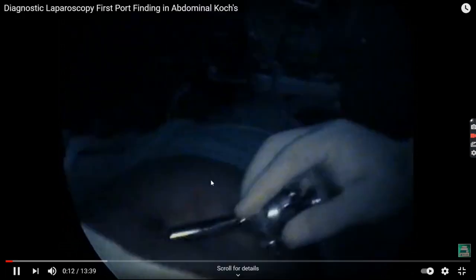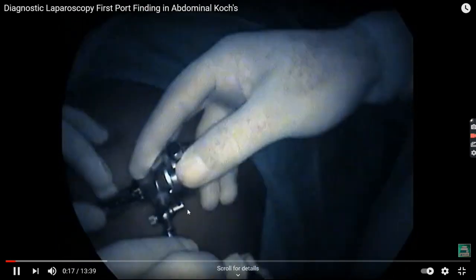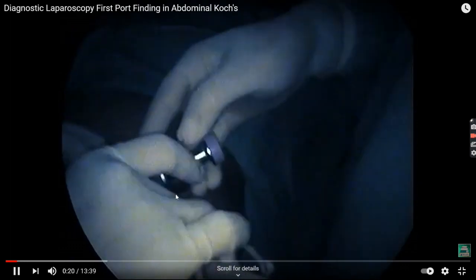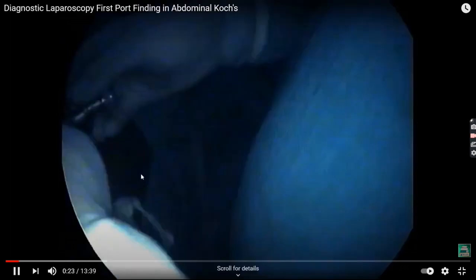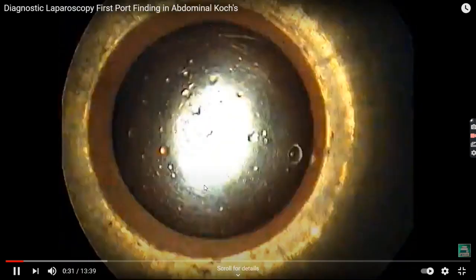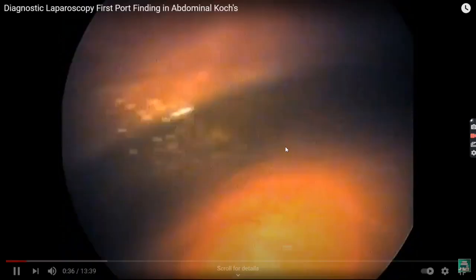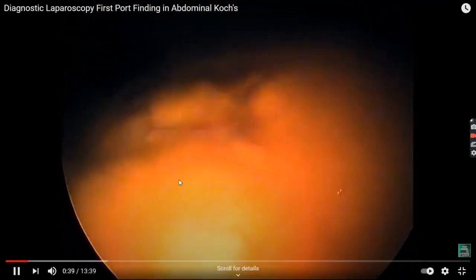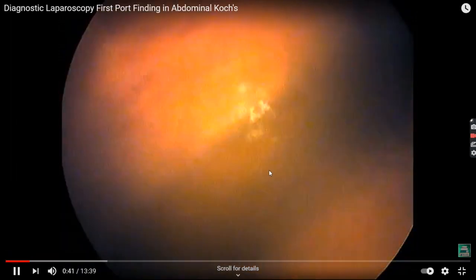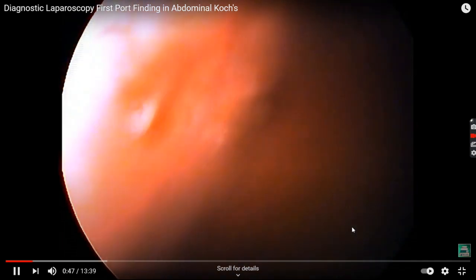I would like to explain it to you. This is the patient, the abdominal part, the intubated, and I have inserted the first port inside the abdomen through the periumbilical area and the connecting tube for pneumoperitoneum connected. And here you can see all these things. These are basically the ascitic fluid, right?